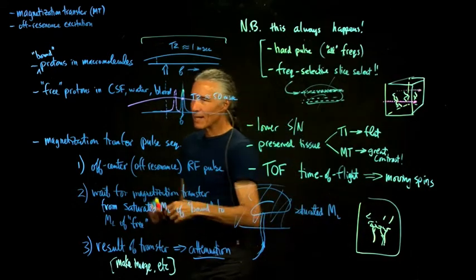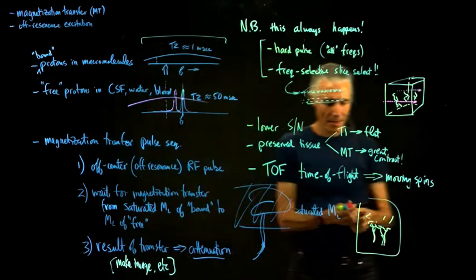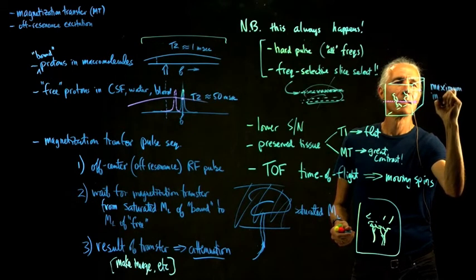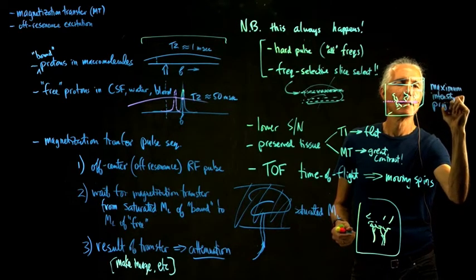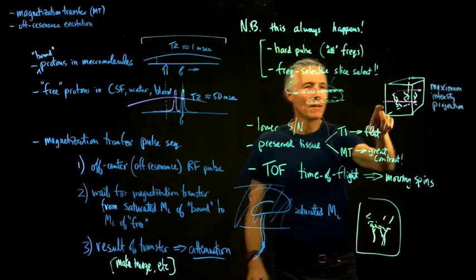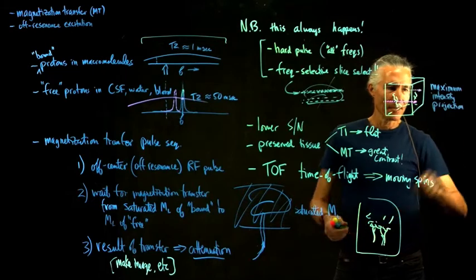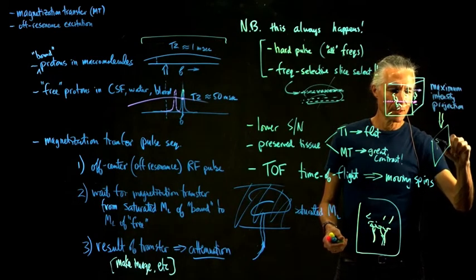And for each line going through the image, just find the brightest voxel. That's called a maximum intensity projection. So all you do is draw a line through the image, find the brightest voxel, you're done. And then make a 2D image out of that. So what you end up with is a 2D image, and then you see blood vessels in it.